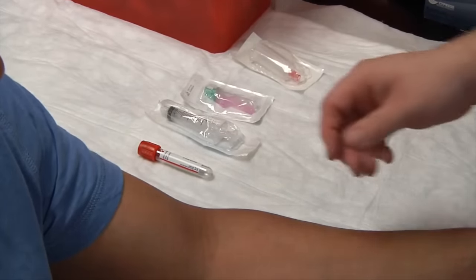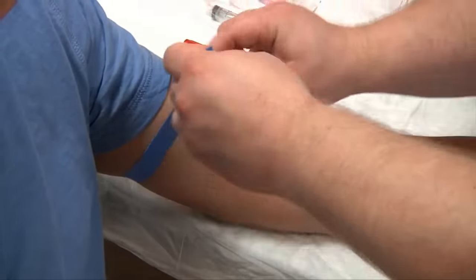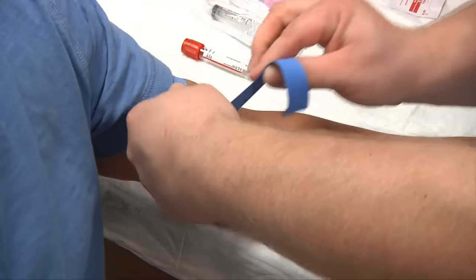We'll need our tourniquet — go ahead and apply this now. I've already asked my patient for consent and explained the procedure, and I've previously washed my hands.